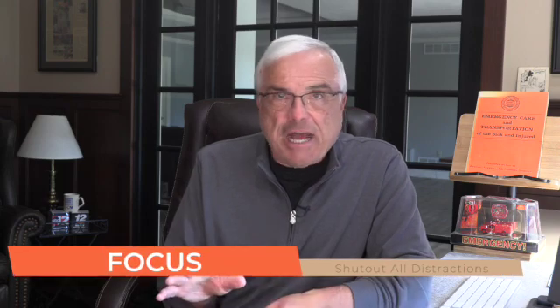How do you increase your chances of success? Here are some tips that may work for you. The first is focus. You have to shut out all the distractions like bumpy roads, sirens, smells, distracting injuries, and abrupt truck movements that come with running lights and siren in traffic. Next, focus on finding the best possible vein. Tips on finding the best vein are coming up.